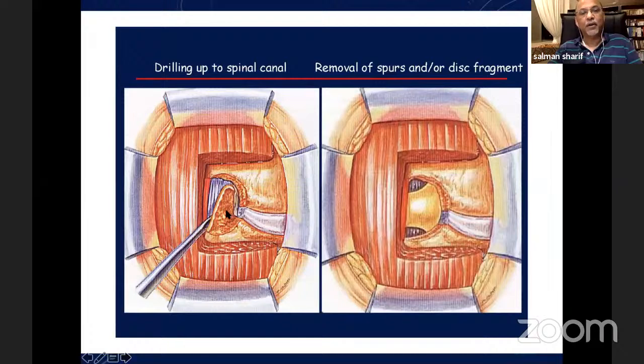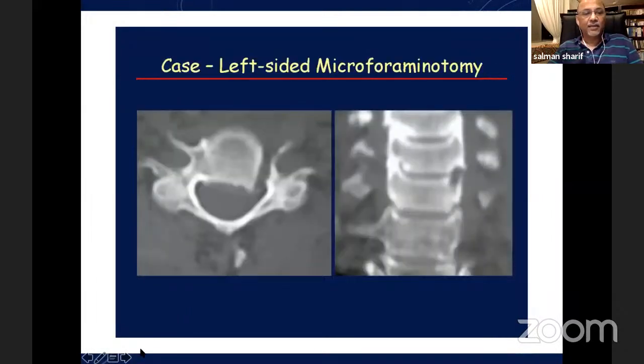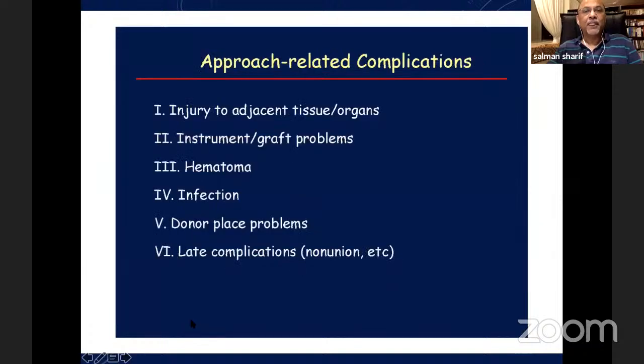So you can see this is how, at the end, you leave this bit of bone at the end, and you just lift it with a hook. And these are the results of this patient.